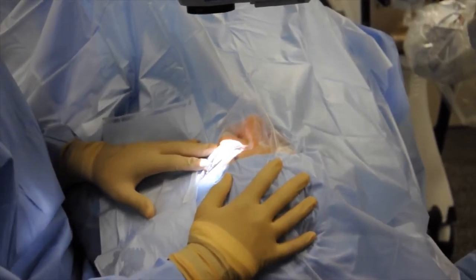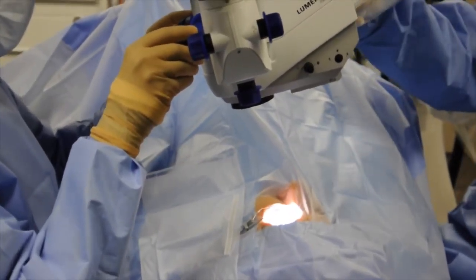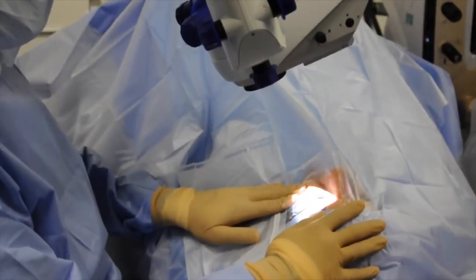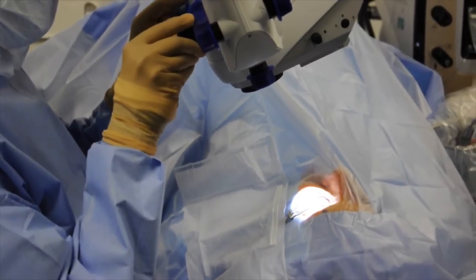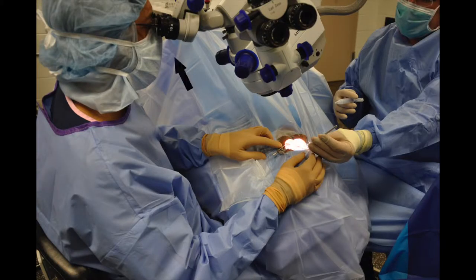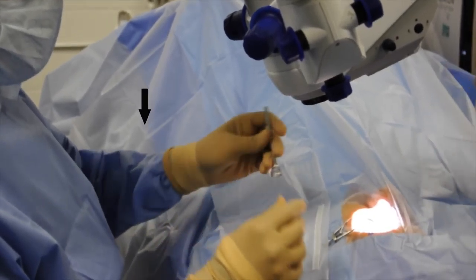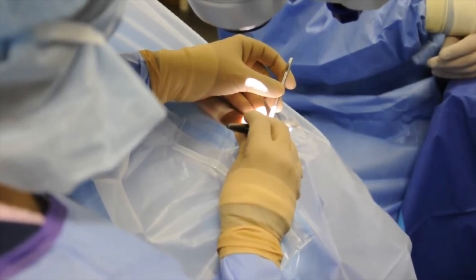To access the nasal angle, both the head and microscope are rotated in opposite directions about 30 to 40 degrees. Note that the coaxial light is no longer perpendicular to the corneal surface. The goal is to align the coaxial light along the axis of the iris plane. Note the increased working distance between the microscope oculars and the surgical field. As a result, the elbow of the non-dominant hand is extended from the flank anteriorly, and this extension can be appreciated from the surgeon's viewpoint.